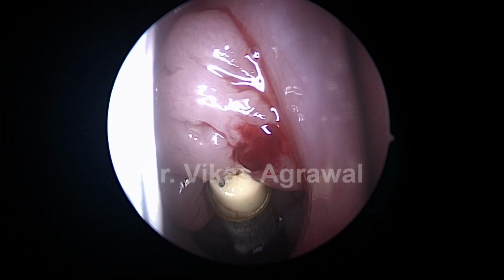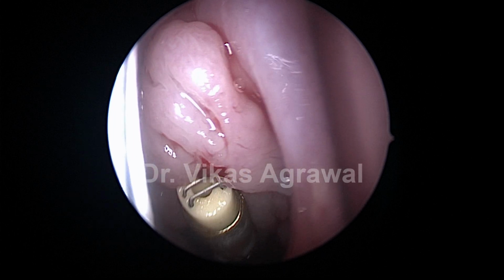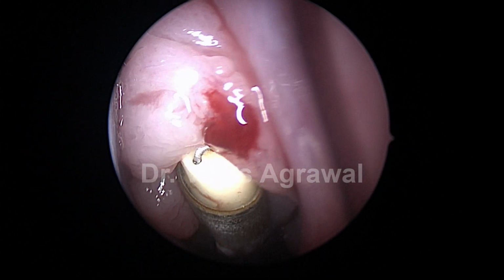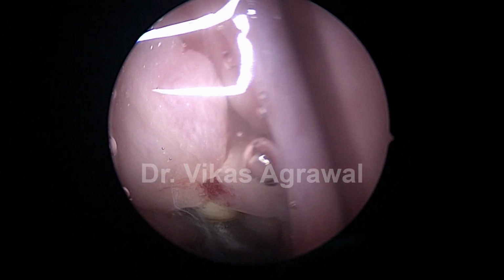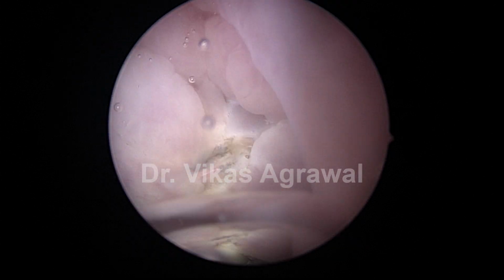So here you are watching coblation adenoidectomy grade 5 in a 9-year-old child. You can see the adenoids are coming into the nasal cavity and therefore we call them grade 5. So I have to debulk the adenoids before I can go on to the boundaries.